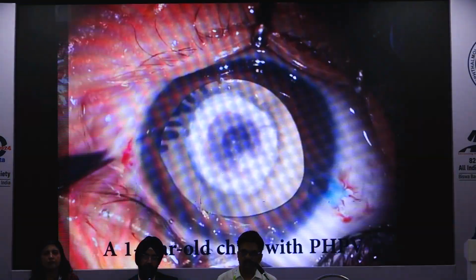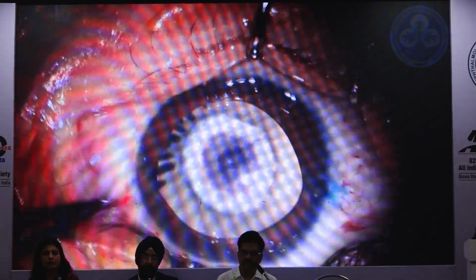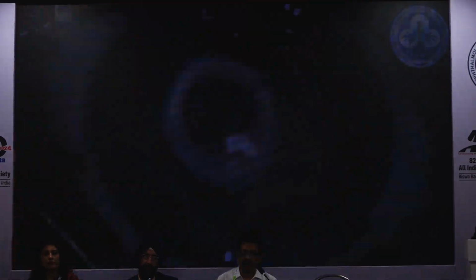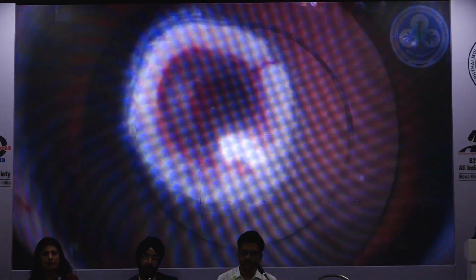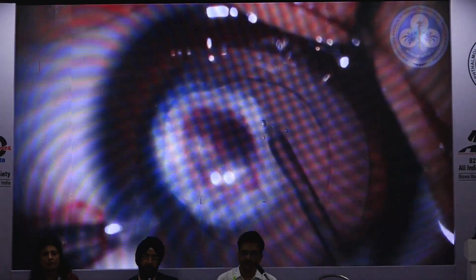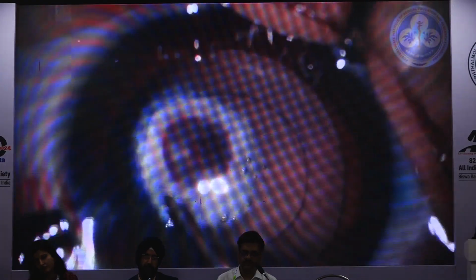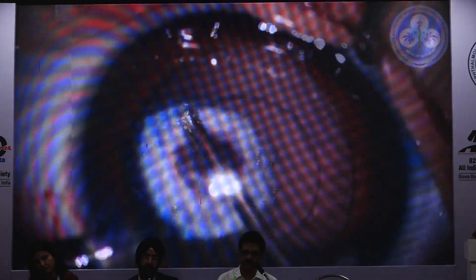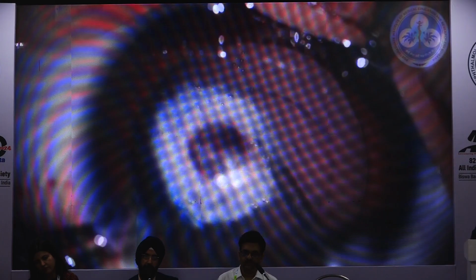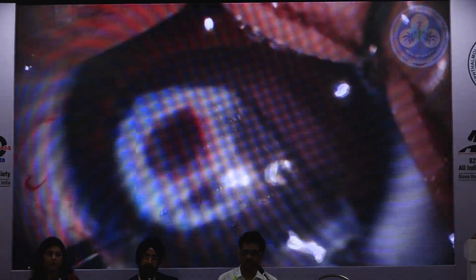Then probably the last clip where it is a 1-year-old child with PHPV. It is a hemorrhagic type of PHPV. This is again a complicated situation where we have to do cauterization of the vascularized posterior capsule and primary posterior capsulotomy.